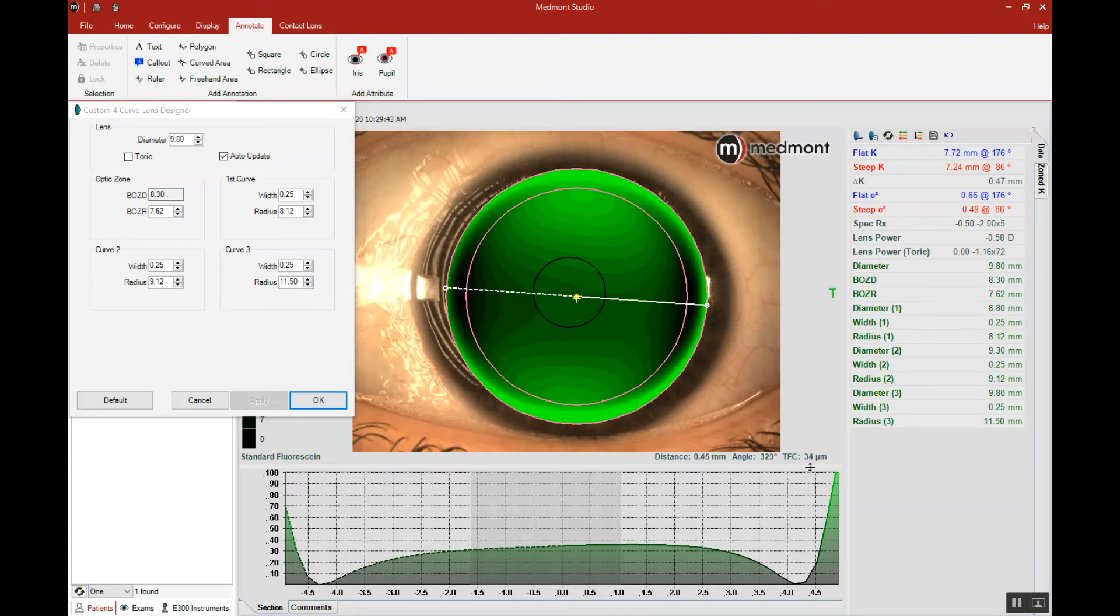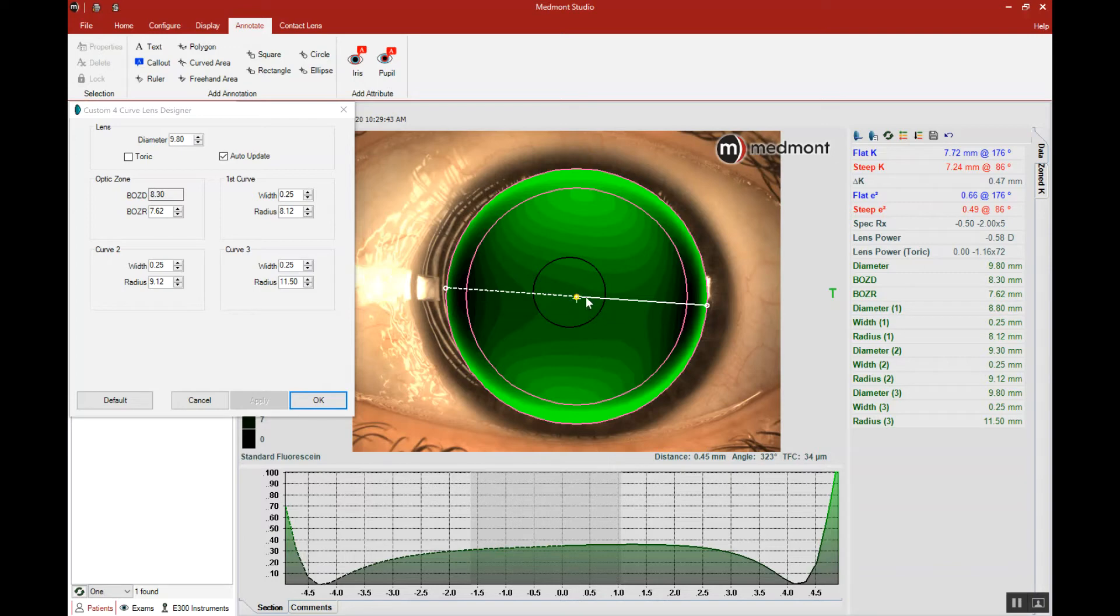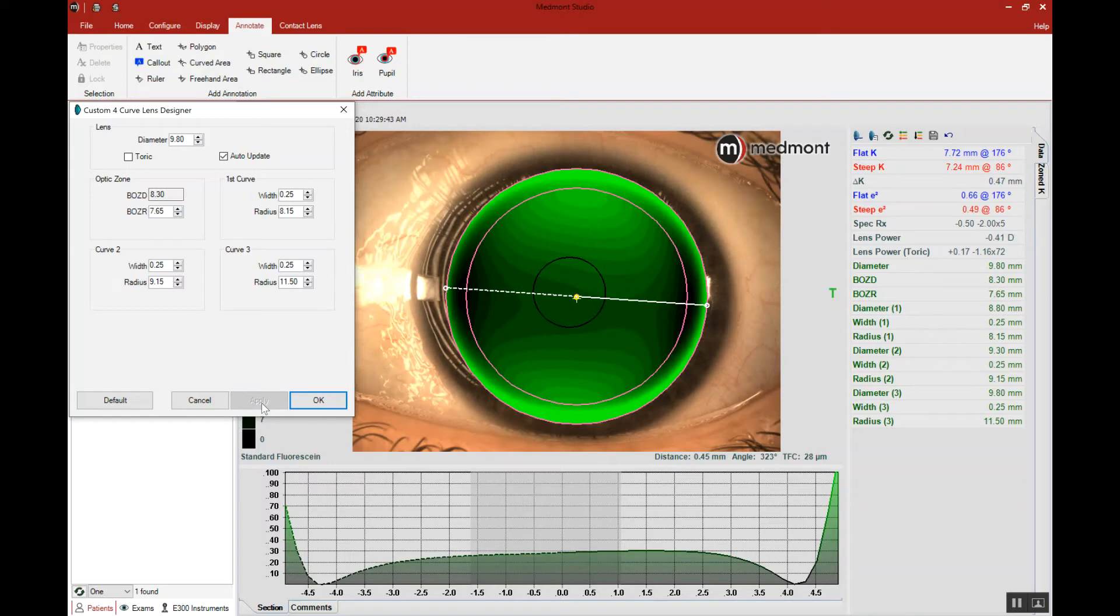We have a lens with 34 microns of apical clearance. There's a fluid layer thickness of 34, and the target is approximately 20, maybe up to 25. Let's flatten the lens to reduce the central clearance. We'll try one click and apply, and that takes us down to 28 microns.